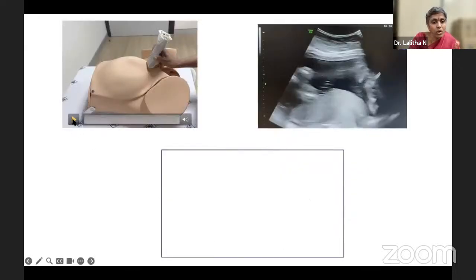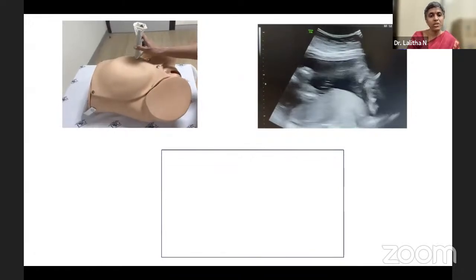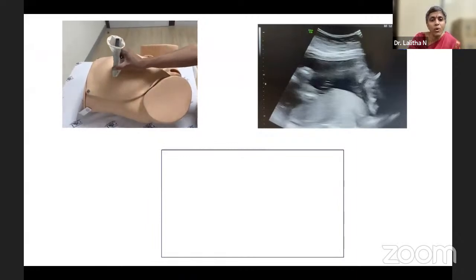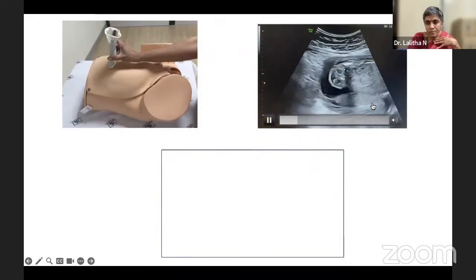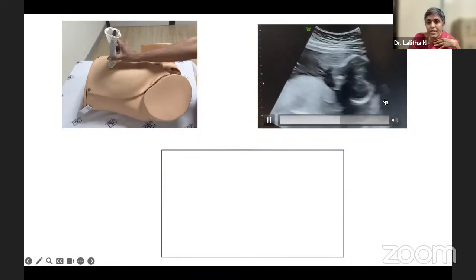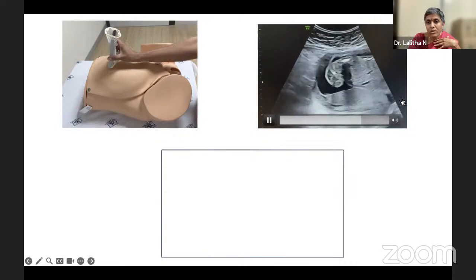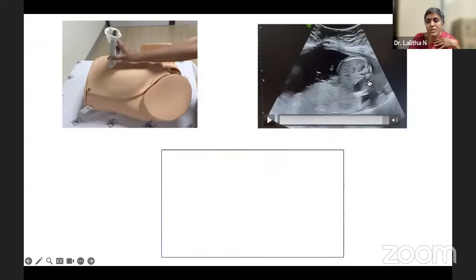So this is a small video on how we go about doing the assessment. I did not want to record on a patient, so I did it on a mannequin. We do an overall assessment of how the baby is lying inside the maternal uterus. So the image will show you this. Here, as we browse through, we see the placenta is posterior, the fetal head is down. And on rotating, here we see the spine on the maternal left. So indeed, this baby is lying with the head down, spine on the maternal left, so the baby's left side is down.